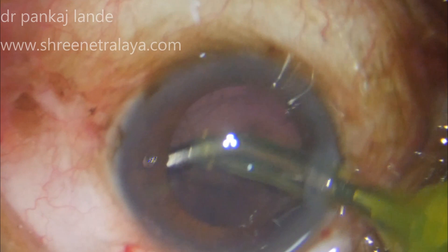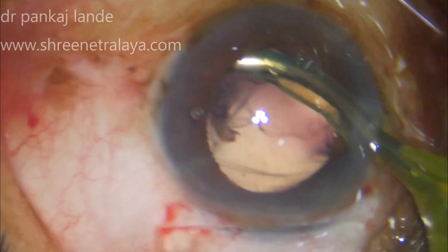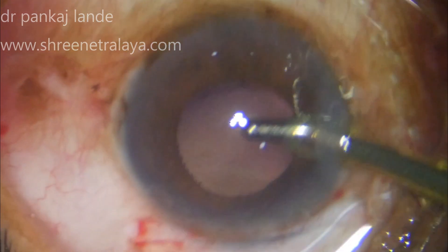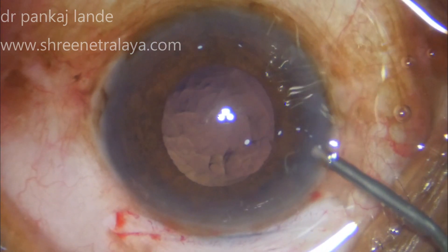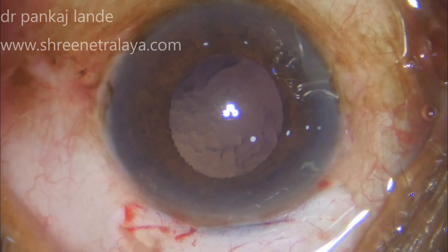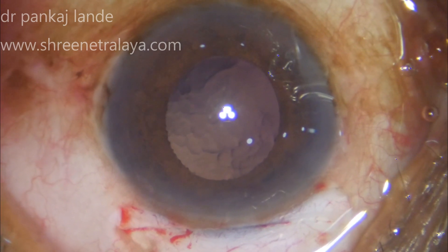This way you can prevent pressure on the zonules and take the nucleus out quite easily. Protecting the endothelium with viscoelastic is equally important. This is followed by irrigation and aspiration, where I am using my coaxial IA to remove the cortex. You can use coaxial, bimanual, or a Simcoe cannula depending on your comfort.